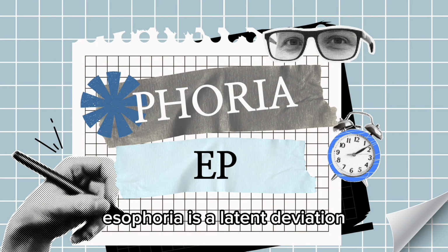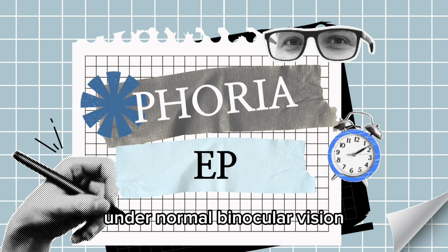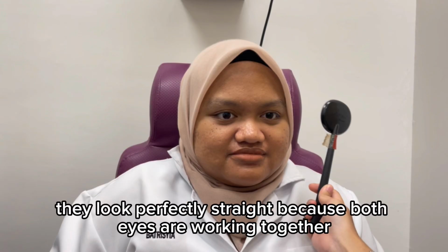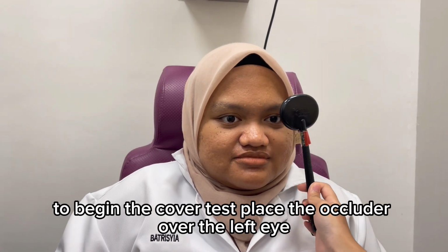Esophoria is a latent deviation where the eyes have a tendency to drift inward. Under normal binocular vision, fusion keeps them aligned so the deviation is hidden. First, look at the patient's eyes at rest. They look perfectly straight because both eyes are working together. To begin the cover test, place the occluder over the left eye.